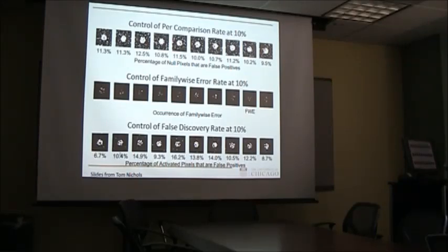And what this does is say, well, in the long run, so averaged over all those 10 images, 10% of the time, 10% of my observations, 10% of the things I'm going to call statistically significant are actually not. Right, and what happens in here, if you look at that, is that you get a lot bigger proportion of the stuff inside those red circles, right? So you're picking up a lot more of the actual signal, but you're also making more mistakes, right?